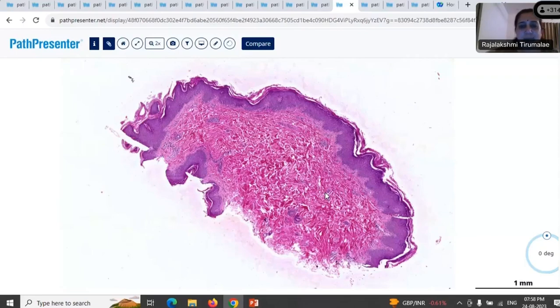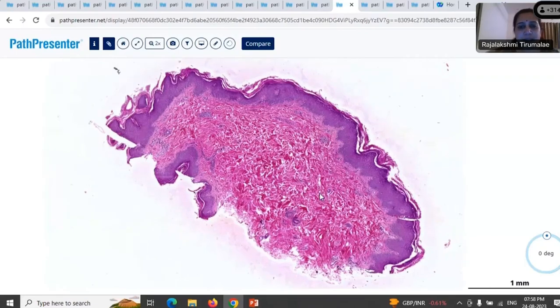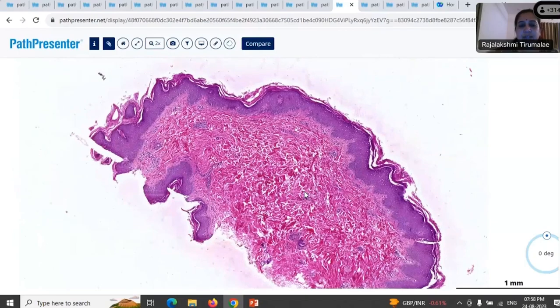You know which is the dermis and epidermis, right? Yes, ma'am. So is there any pattern of infiltrate that you're seeing in the dermis? Yes, ma'am. Okay, what is it? So, ma'am, the hyphae, is it either an artifact or proper mycosis? Okay, we'll go to that. But right now at this magnification, what are you seeing? There's a reason that I've given you this biopsy. Yes, ma'am.